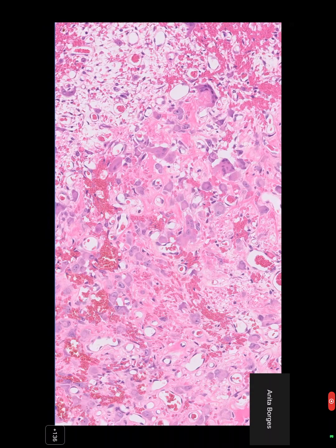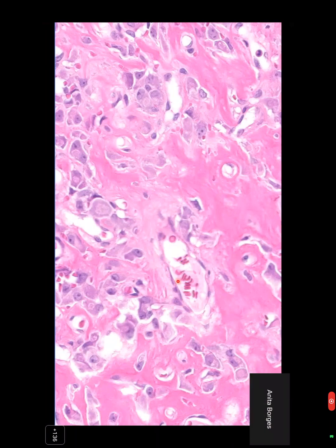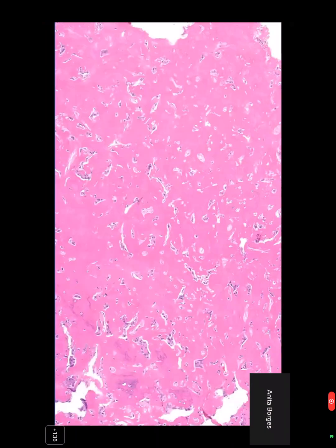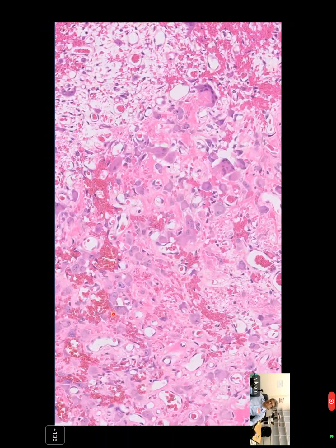Yes, I agree. And of course these large areas of dense bone formation, you don't really see that in osteosarcomas; it would be very unusual. That's very helpful. It's very prominent vascularity, and it shares that characteristic with an osteoid osteoma. And that distinction, interestingly, between osteoid osteoma and osteoblastoma is entirely arbitrary, right? That 2 centimeter rule. That's right. They have the same genetics, so perhaps it's time to change that nomenclature as well.